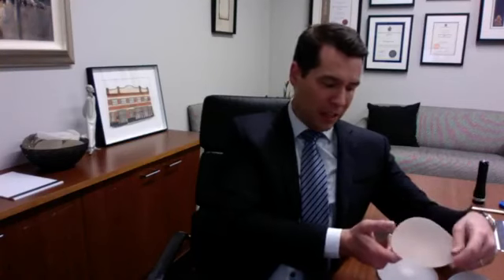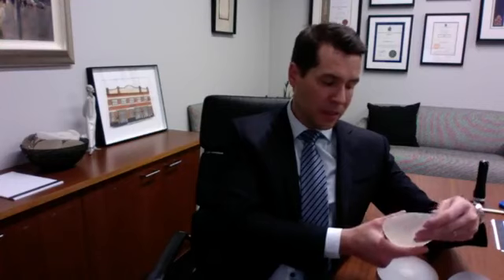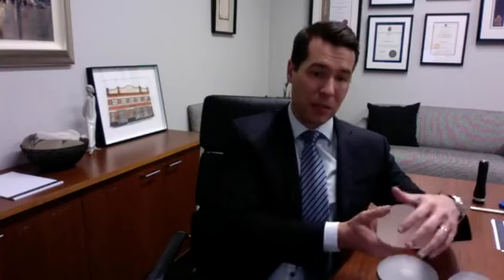For the implants that we may need to use for people, for certain things, where I need shape, and we're looking at using a teardrop device that until recently has only really been available in a micro-textured or a macro-textured device, then the incidence rates that we're aware of in terms of 1 in 86,000, they're the things that we tell people so they can make an informed decision.